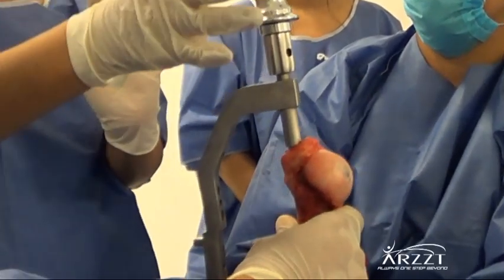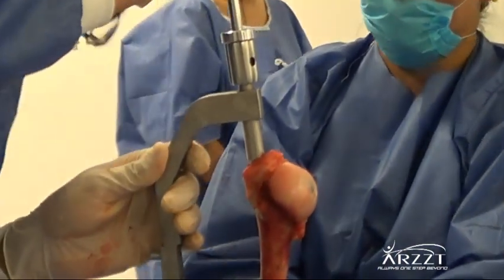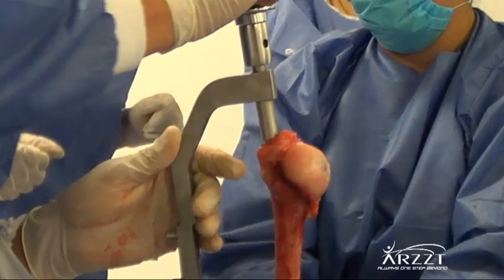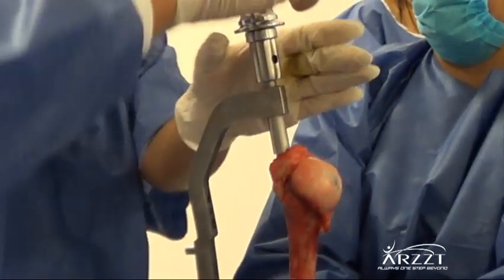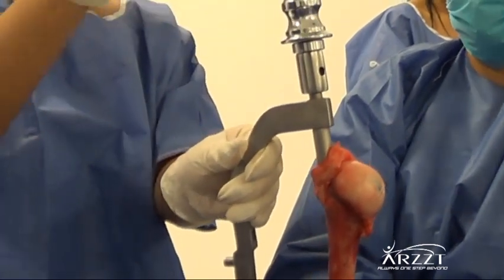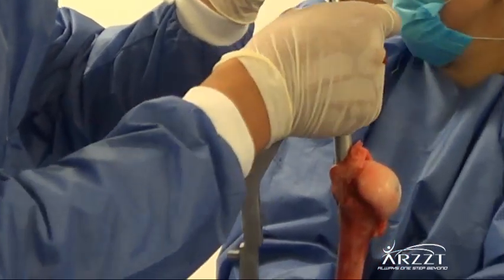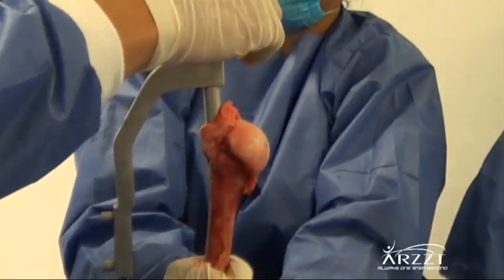Observing both anteroposterior and lateral projections, you can use the impactor to advance the nail, always keeping the flex handle guide directed toward the lateral side of the arm. Perform fracture reduction aided by the image intensifier and slide the nail until the proximal mark exceeds the start of the entry hole.